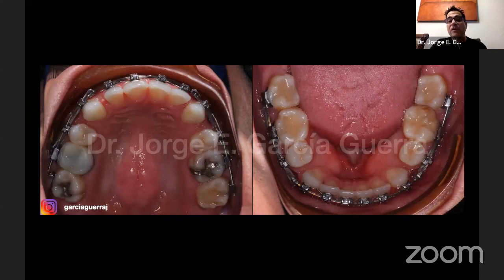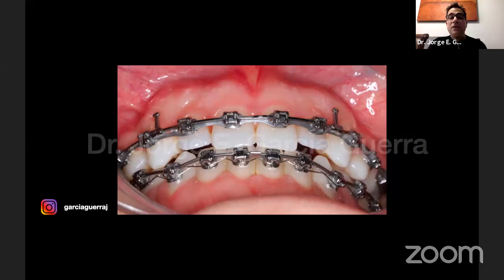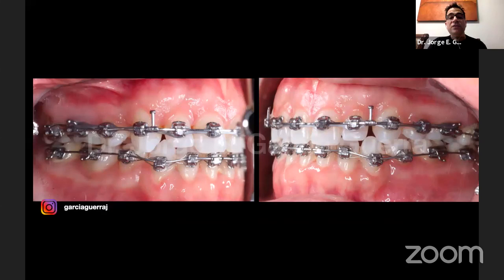So we decided to put, you can see here we're closing in stainless steel wires. We did some bracket repositioning, but we still have some spaces there. You can see the overbite, even though we're using high torque brackets. We're still finishing to close the space on the upper. In a lot of the cases where we're closing spaces, if we close the lower arch and still have space on the upper arch, it could be a Bolton discrepancy, a tooth size discrepancy, or this excessive overbite.